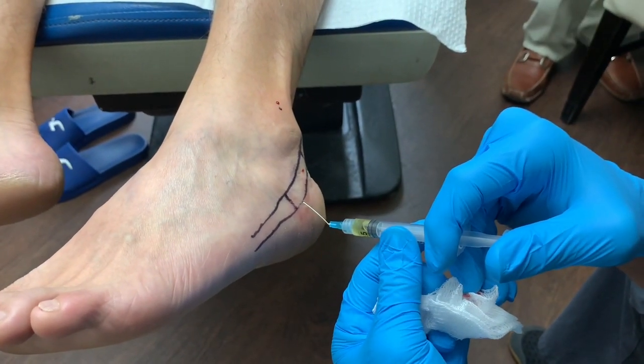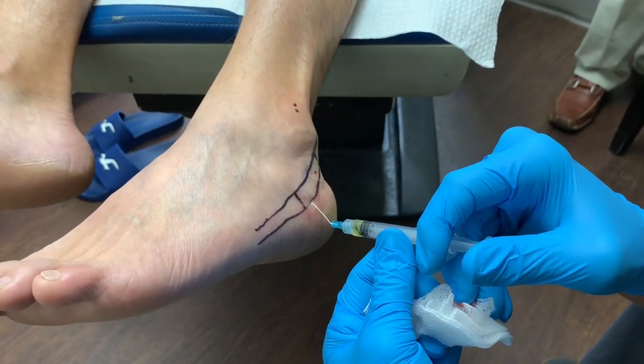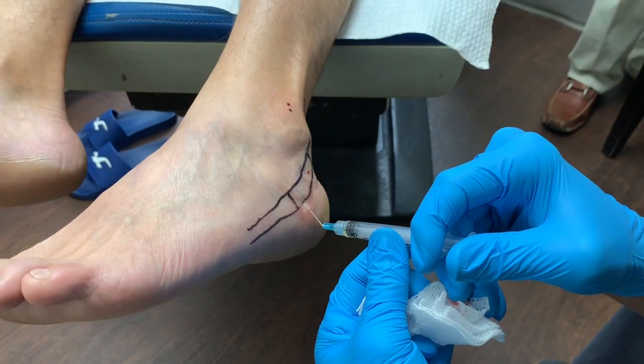And this is going to be the last one right here. Okay, and we're done here on this side.